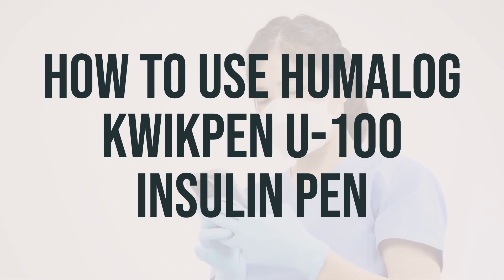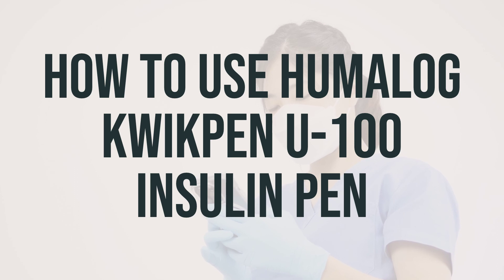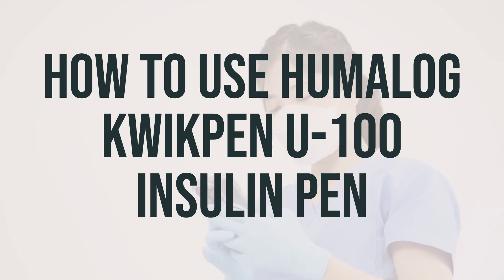Before you start using this medication, make sure to read the patient information leaflet provided by your pharmacist. This will help you understand how to use the insulin pen properly. If you have any questions, don't hesitate to ask your doctor, diabetes educator, or pharmacist. It's important to learn all the preparation and usage instructions from your healthcare professional and the product package.